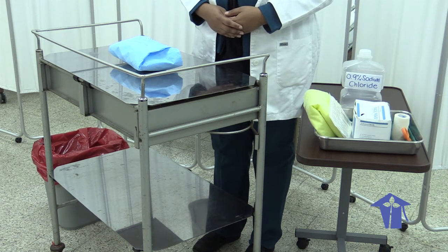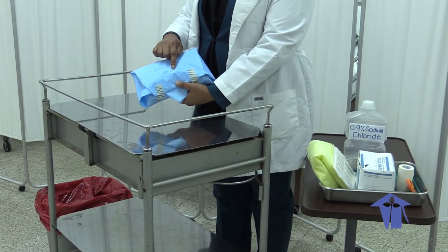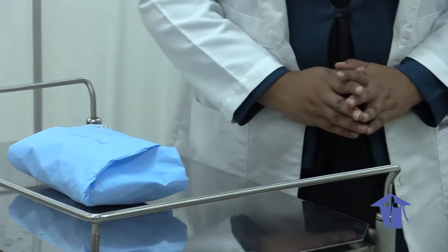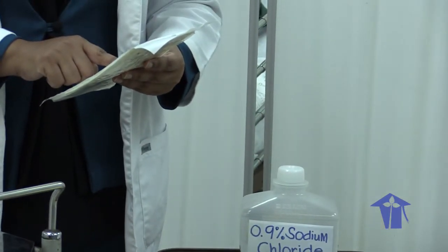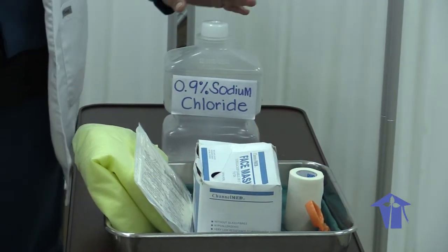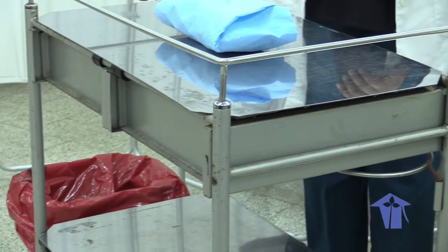Items needed for wound dressing: your dressing pack. Remember to check the label, expiry date, autoclave tape, and the integrity of the pack. Also, you will need your gown, sterile gloves. Remember to choose a size suitable for you and the expiry date, your face mask, tape, scissors, and the prescribed cleaning solution. Additionally, you will need your bin lined with a red biohazard bag.